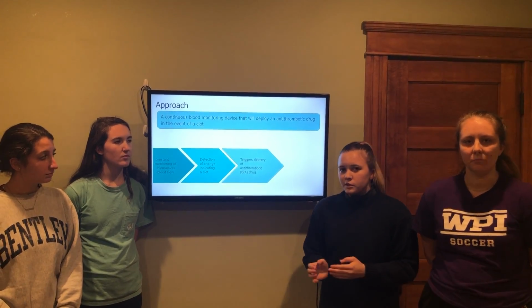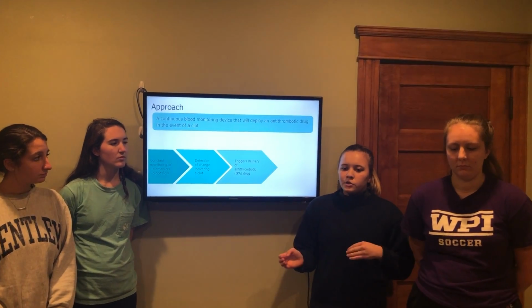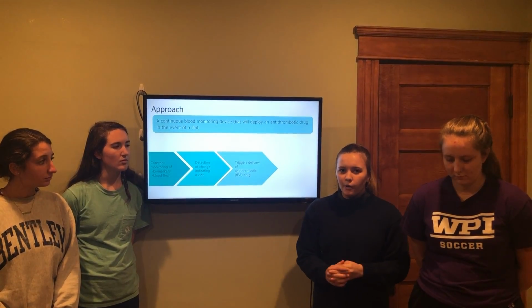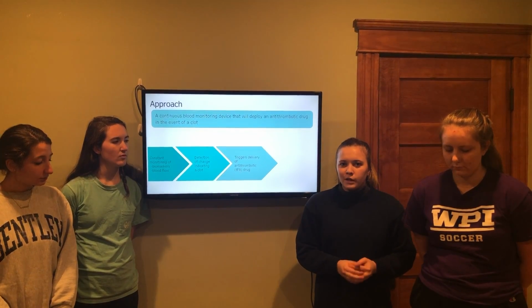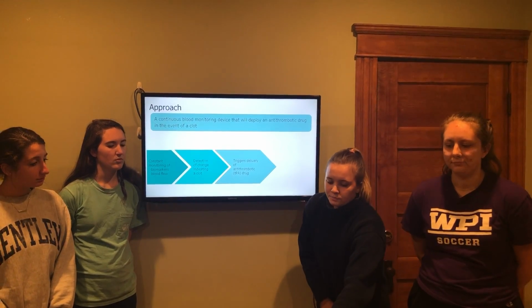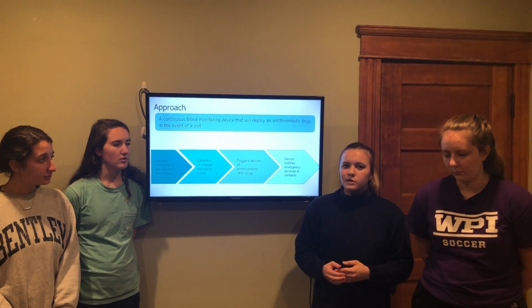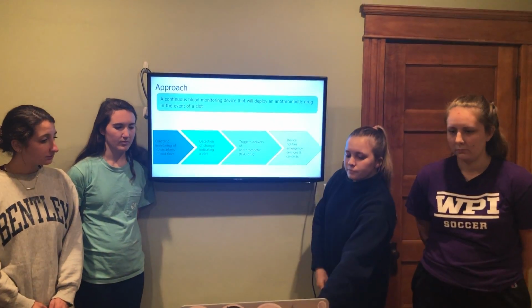The dosage of the drug is determined by the patient's weight, and up to 90 milligrams are sent to the patient through a primary bolus, and then the rest of the dosage is sent throughout the next hour. The TPA drug works by breaking down the fibrin in a blood clot, which restores the normal blood flow rate of the patient. All of this data is then sent to the receiver, which notifies emergency services as well as all the emergency contacts for the patient so that they can receive further care.